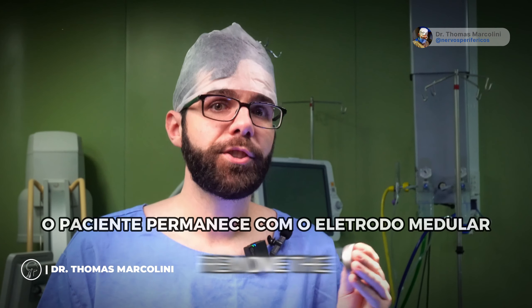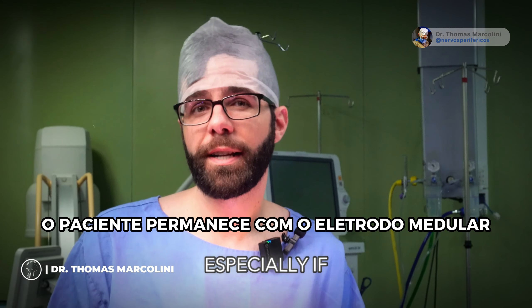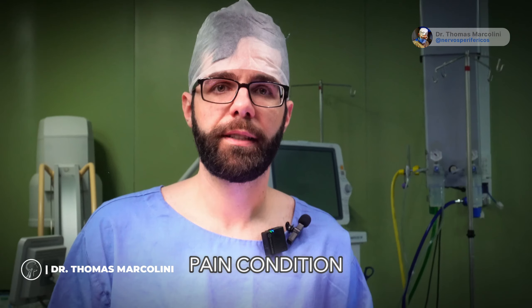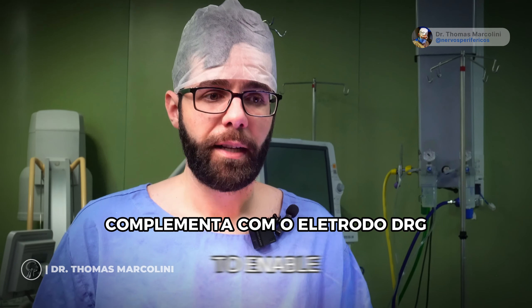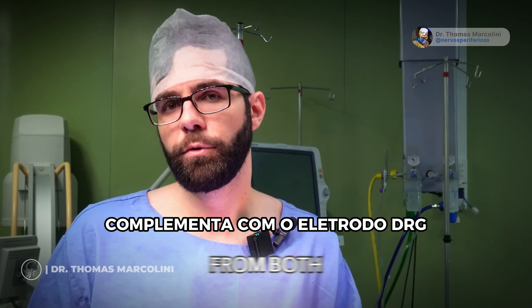This patient does not need to remove the spinal electrode, especially if he has a partial response in his pain condition. Maintain the paddle lead position and establish the DRG lead connection to enable the combined stimulation from both devices.